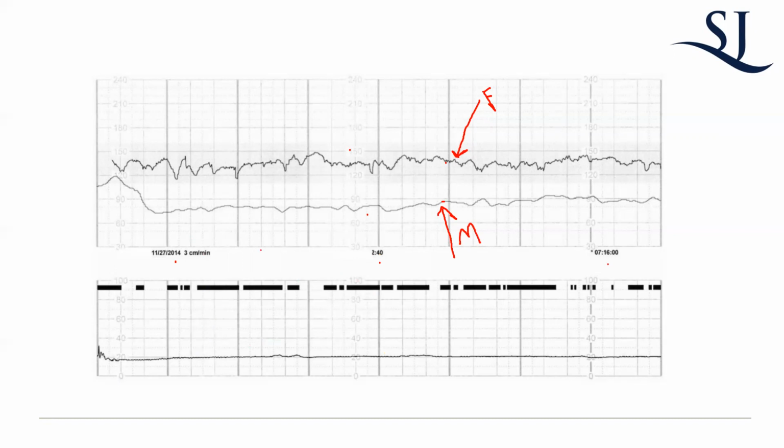Yep, excellent. The uterine contraction. So obviously this mom here is not contracting at all because it's a straight line. But your activity will look something like this, right? So each of these boxes is about a minute.